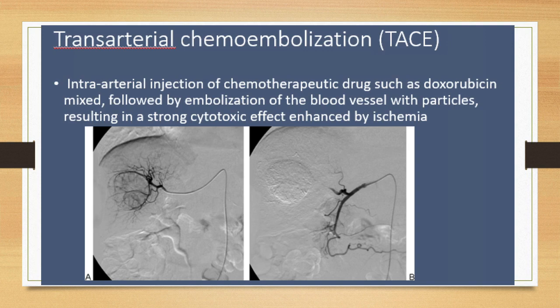So basically what they can do is, through this catheter, inject the chemo directly into the mass. As opposed to doing systemic chemotherapy, they inject it right into the area of concern. So they get into the small little vessel. At the same time, they'll do embolization of the surrounding blood vessels so that the chemo doesn't go into the other parts of the liver. So this is post. Here he's still injecting that same area, and you can see there's no enhancement of that area anymore. All those vessels supplying that tumor were killed. So that'll treat the cancer right there.